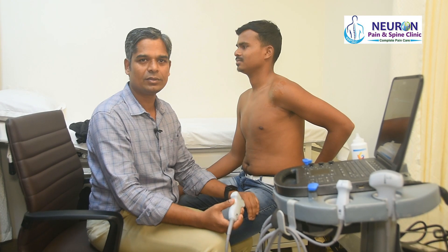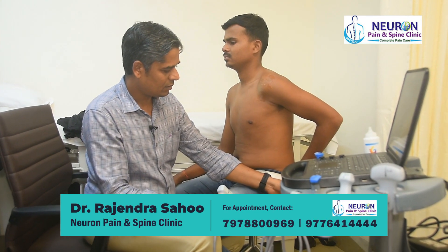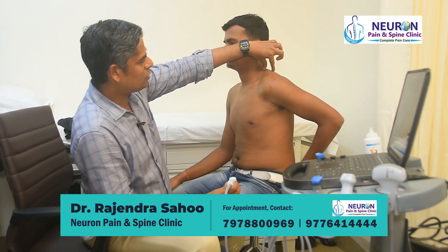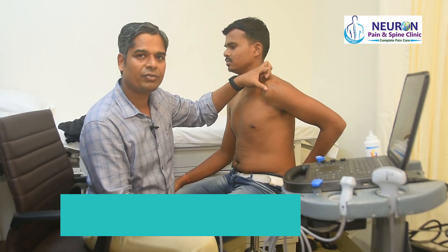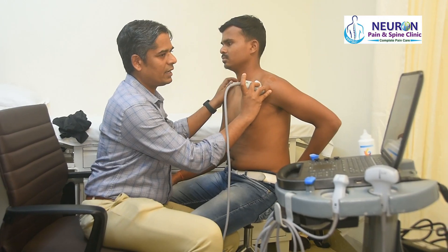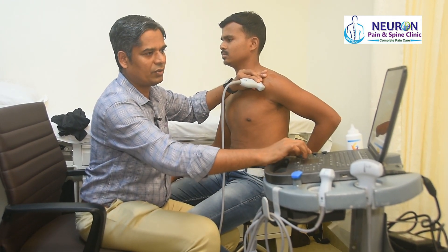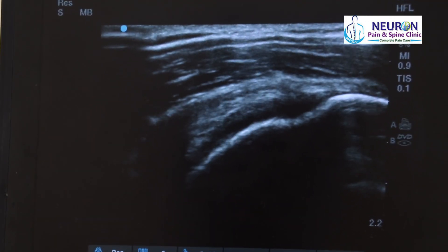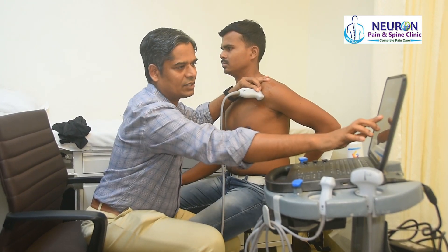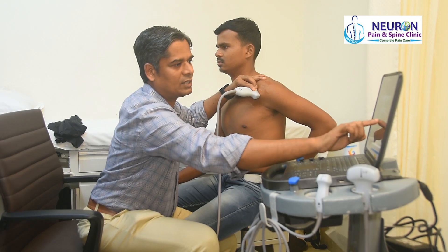Starting with step five in the modified cross position — comfortably seated with the hand on the buttock as if taking something from a wallet. The supraspinatus tendon comes and gets inserted over the superior facet of the greater tuberosity. I put one end of the probe over here with the other end pointing towards the ear. This is the greater tuberosity and that is the insertion of the supraspinatus tendon. This is the insertional portion with hyperechoic fibers.